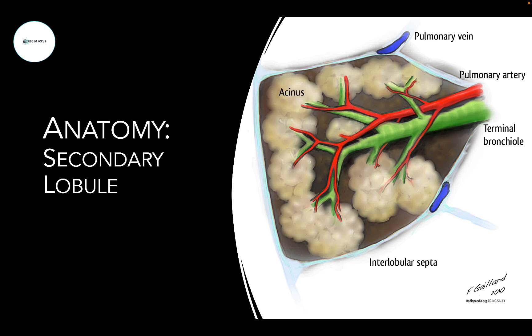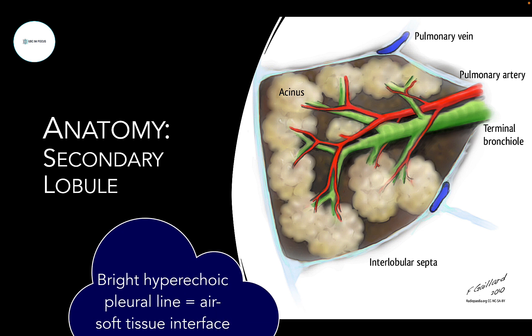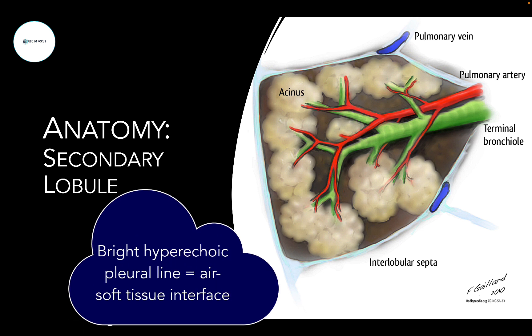In a normal aerated lung, the ultrasound beam doesn't penetrate beyond the pleura. Note that while we refer to the bright white line we see as the pleura line, it's really only the soft tissue-air interface that creates that hyperechoic line — the normal pleural tissue is actually too thin to resolve. When the pleura is pathologically thickened and ultrasound is able to resolve it, the pleura actually appears darker and relatively hypoechoic.